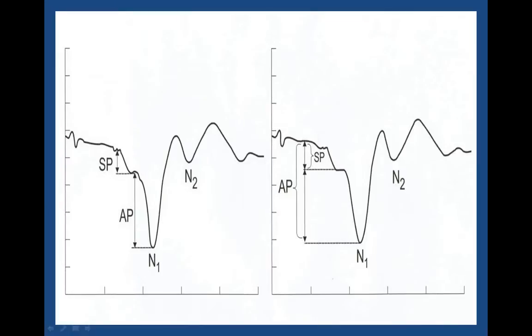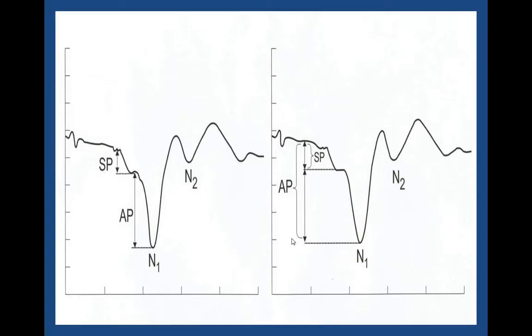You'll find some variance in the literature among people who do this with regard to how they measure these components. You can measure them as absolute amplitudes from where they begin to where they end, etc. The SP in reality actually extends beyond into the AP, but the AP overshadows it. Nonetheless, this little blip represents a portion of the SP that's important, as you'll see in a bit.